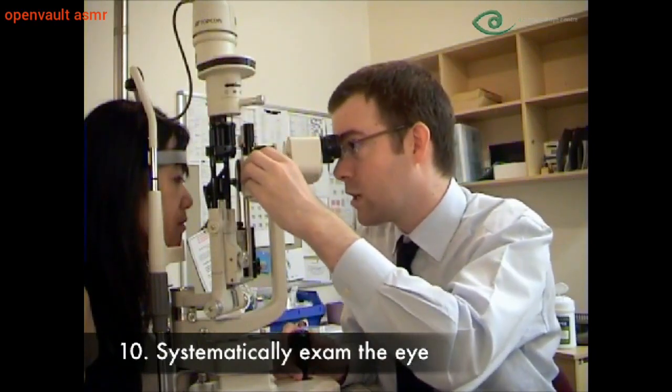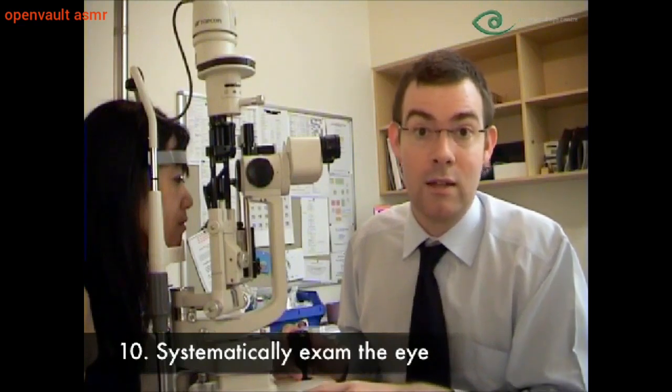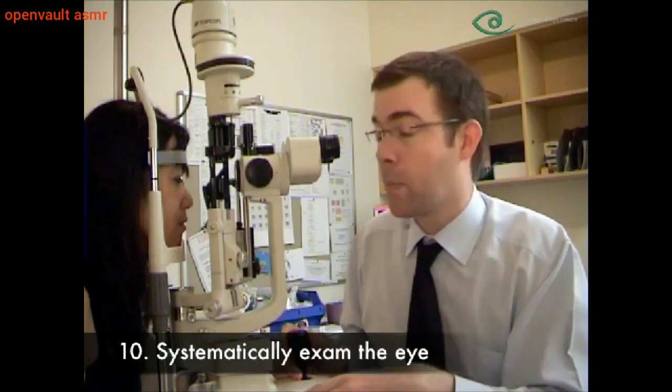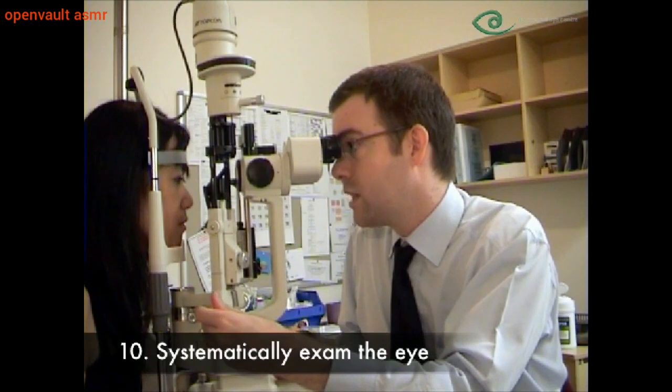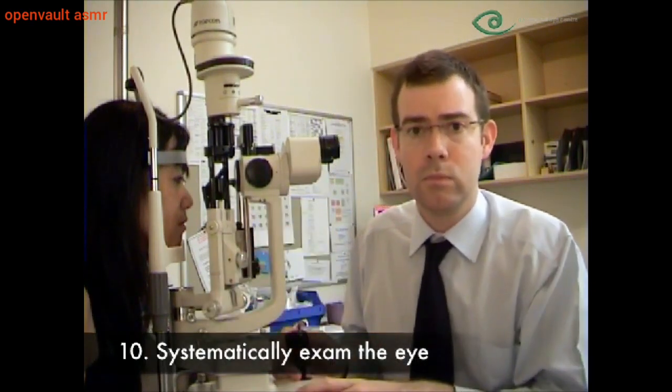To examine the anterior chamber, use a beam about 2 to 3 millimeters high, increase the intensity, and you may also want to increase the magnification and turn off the room lights to aid in the diagnosis of anterior chamber cells. You should focus on the cornea and then push in toward the patient, and now you're focused in the anterior chamber.